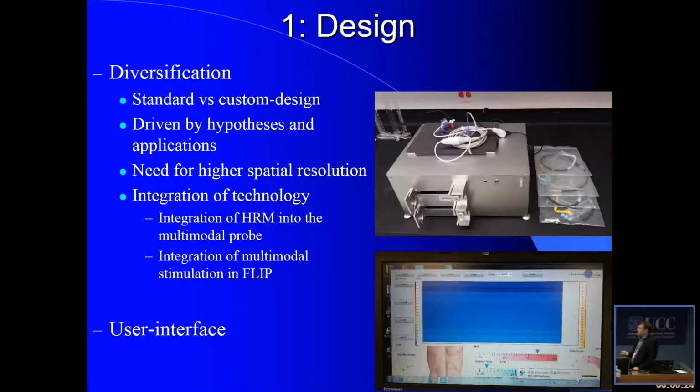I also think that there will be more integration of technology. We have already integrated high-resolution manometry into our multimodal probe. So in addition to stimulating with these 3 or 4 modalities, we will also get a high-resolution pressure profile. It can quite easily be combined with mucosal impedance measurements. And this is one of our new prototypes that is being produced right now.